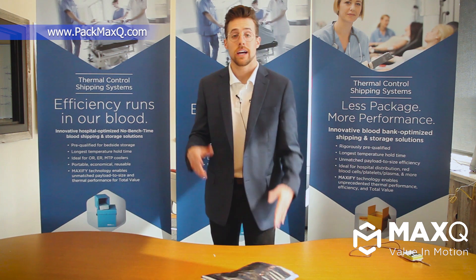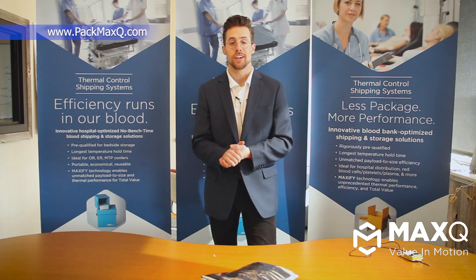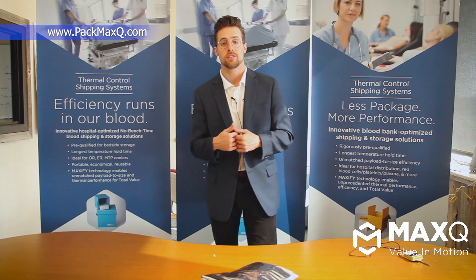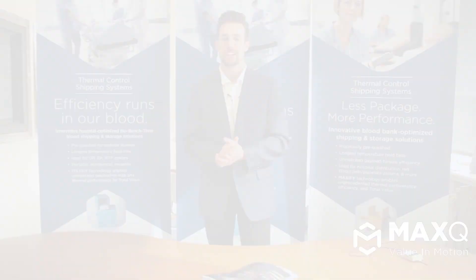That's it guys — that's how the Max Plus Stat Pouch is meant to be used. We're super excited for everybody to get their hands on it and start using it. If you have any questions or general feedback on the product, please feel free to reach out to us. All the contact information is listed below and we look forward to hearing from you. Thanks and have a great day.